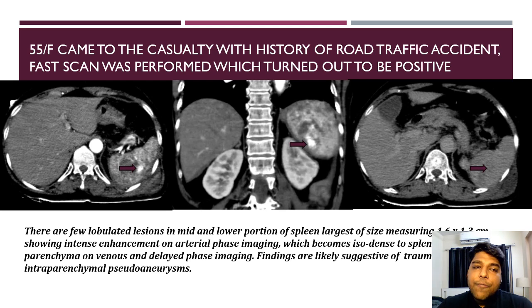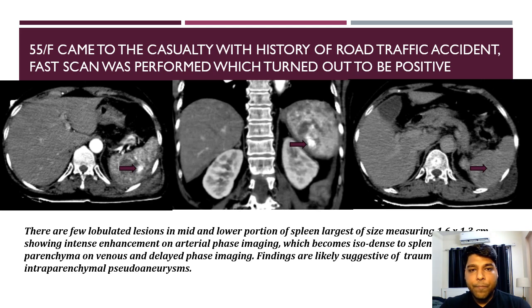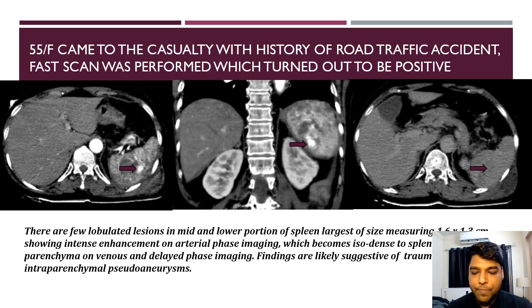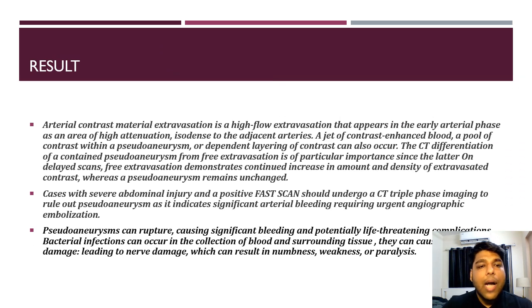Case 5: A 55-year-old female came to casualty with history of road traffic accident. FAST scan was performed which turned out to be positive. There are a few lobulated lesions in the mid and lower portion of the spleen, the largest measuring 1.6x1.3 cm, showing intense enhancement on arterial phase imaging which becomes isodense to the splenic parenchyma on delayed phase images, findings likely suggestive of traumatic intra-parenchymal pseudoaneurysm.